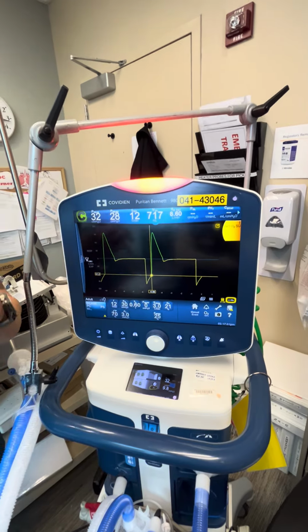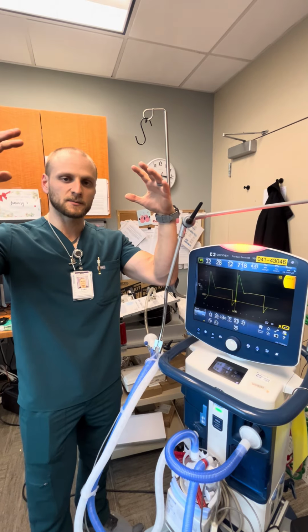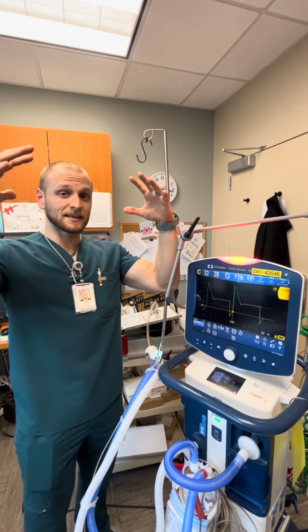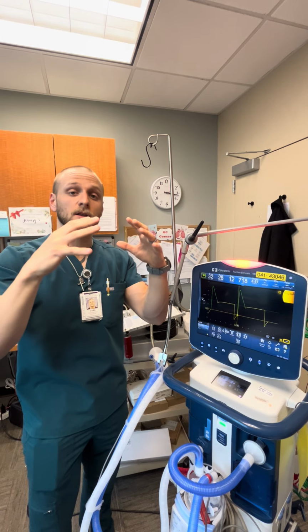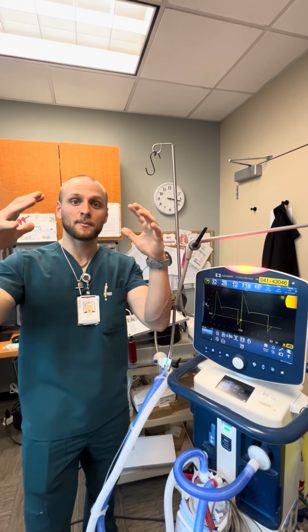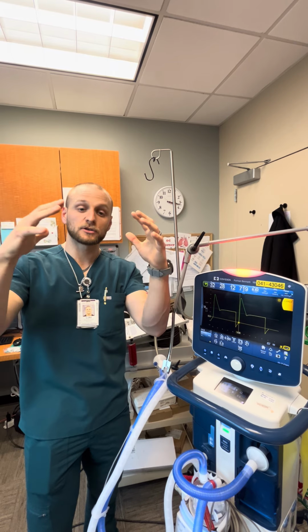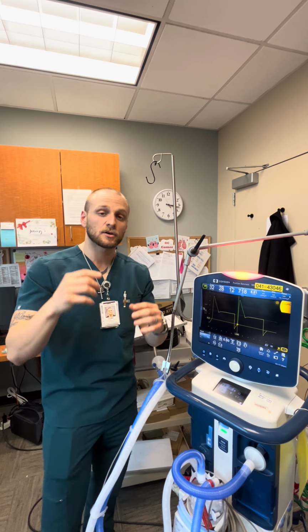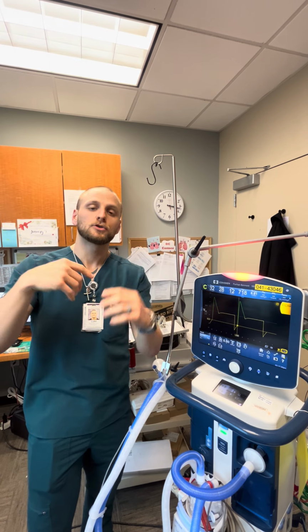So what's happening in your body is your lung are coming up at the outermost part of that peak inspiratory pressure, that P high. The flow, when we release that lung, is the fastest in the beginning. And as that lung contracts, it slows down. So we need to stop that. In this scenario, we need to stop it at a flow of 75. Right now, the lung is going too long and it's slowing down too much. So we need to adjust our T low to where we stop that lung from collapsing sooner.